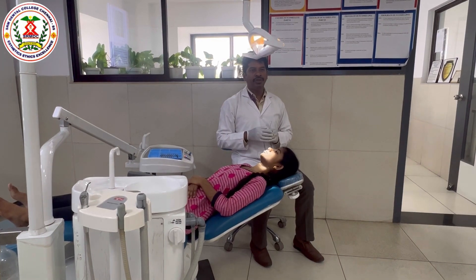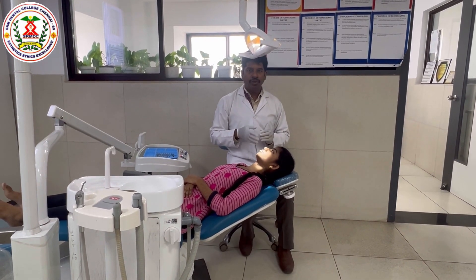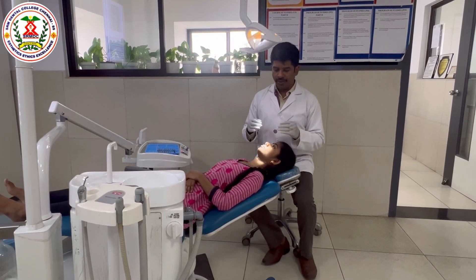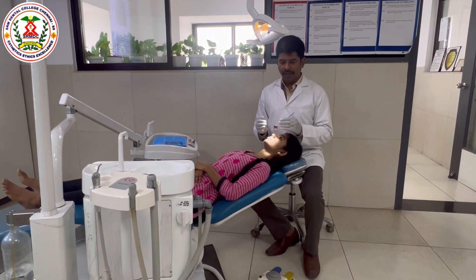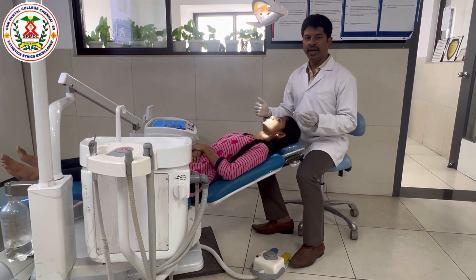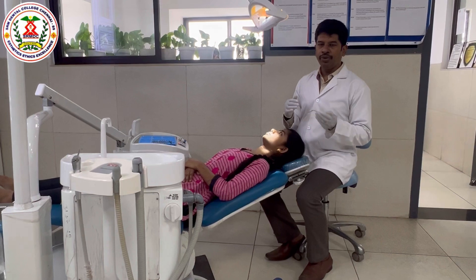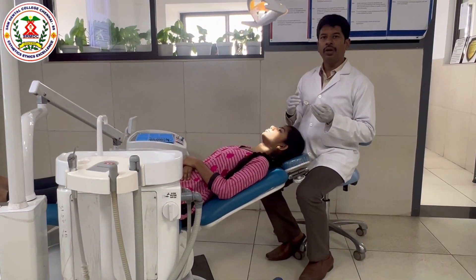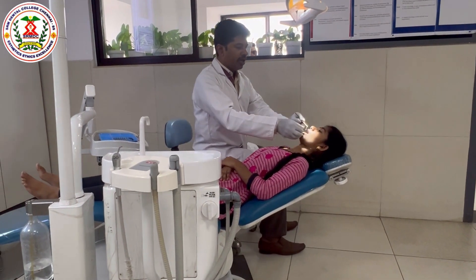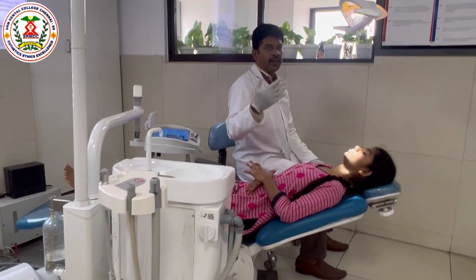The next is the doctor's position. The right-handed dentist has a few postures to work in. The main position is the 12 o'clock position, and there are positions at 11 o'clock, coming down a bit closer to the patient, and further positions around the chair. Each position allows you to access different areas of the mouth without disturbance. The movement range is from about 9 o'clock to 12 o'clock, with one extended position at 7 o'clock, which is only for the lower mandible — where you sit at 7 o'clock and treat the lower mandibular teeth. The same concept applies in mirror image for left-handed dentists.